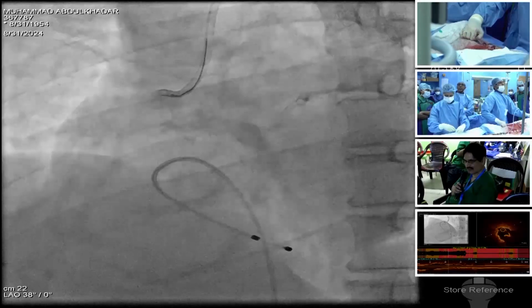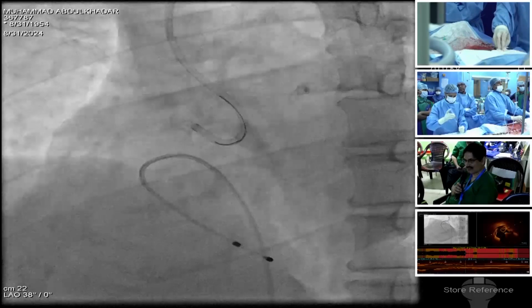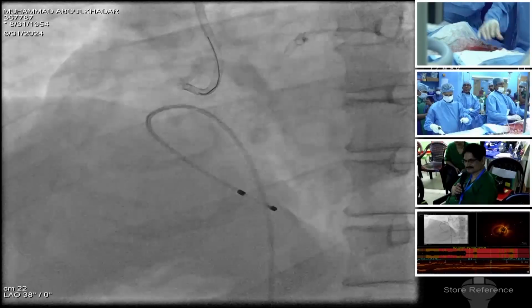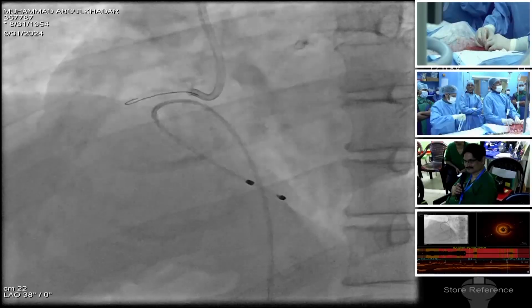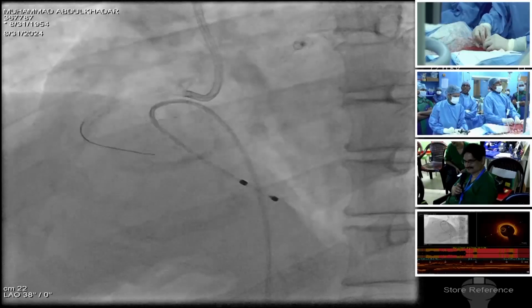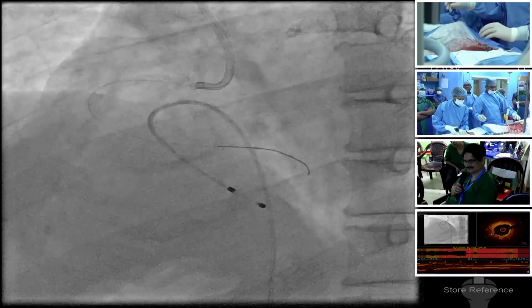So this is what most of the time we would see on OCT even after rotablation. You wouldn't see any wonders happening inside the vessel. You would see some polishing. The nodules might remain there itself. But ultimately at the end of the day, you'll be able to crack the lesion with the balloon, and you'll be able to track the stent also. You are correct. You don't have to regret that you didn't do a rota, you didn't do an orbital.